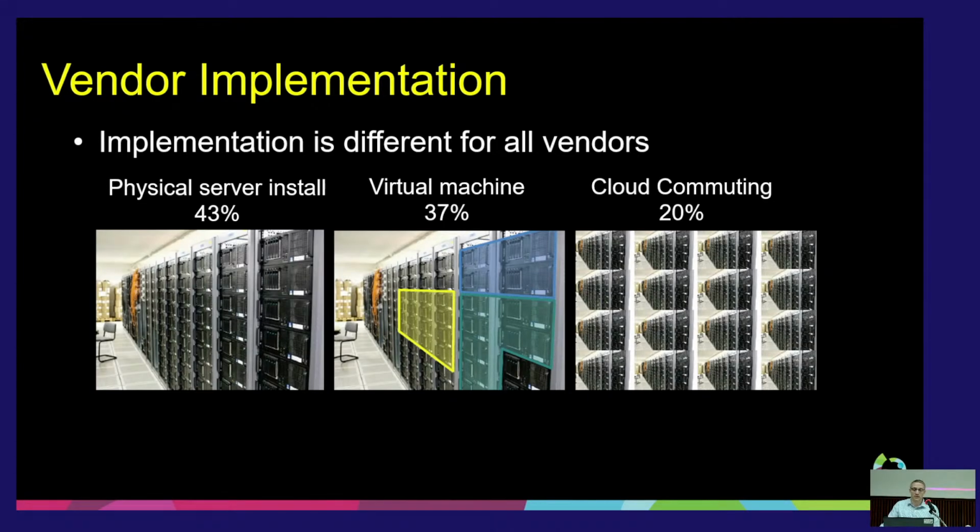Some of them will allow you to do what's called virtual machine. In this case, you'll have a certain amount of servers already at the hospital. And then you'll just take a certain allocation from each of these servers, and your IT specialists are able to help you do that. This is nice because you don't necessarily have to have a dedicated server. You can just use the extra space on different servers, and it all comes together.